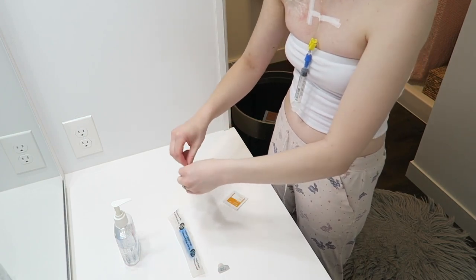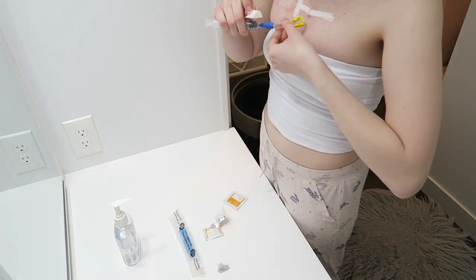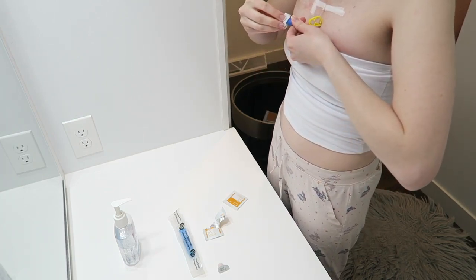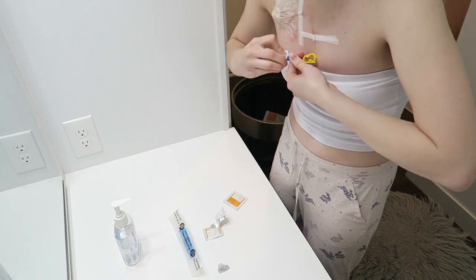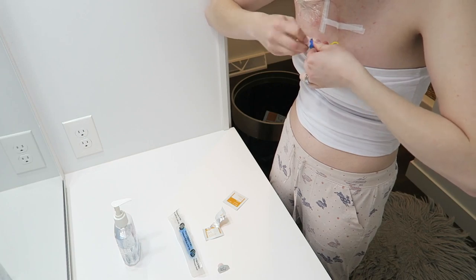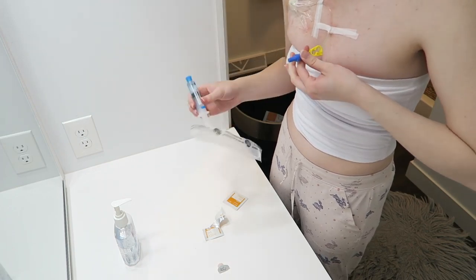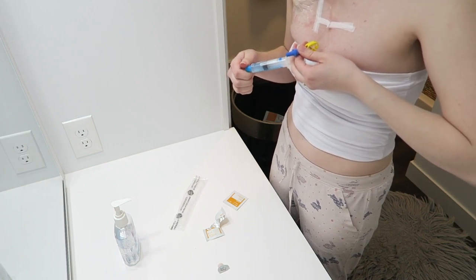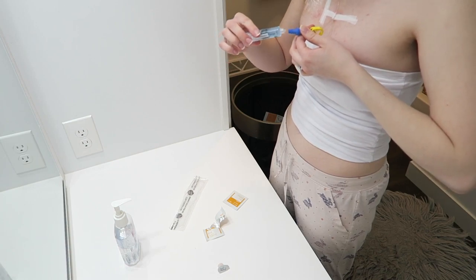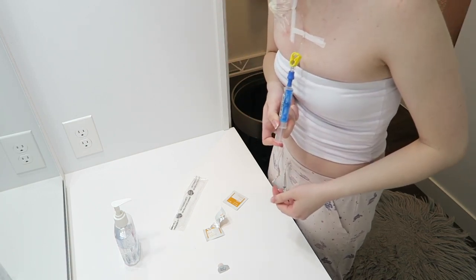And then I'm gonna go ahead and take my alcohol prep pad and disconnect from the saline. And I'm gonna go ahead and scrub the line. Even though technically everything under here was sterile, you always want to scrub your clave connector with alcohol. So now that that is clean, we can go ahead and take our heparin, make sure, again, there's no air in it, put it on the end of the clave connector, and push it through the line.